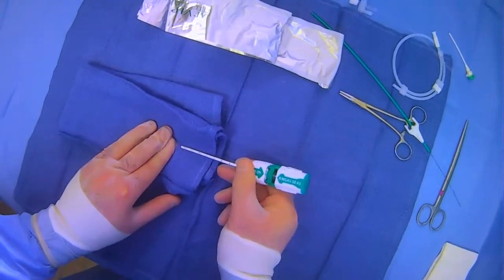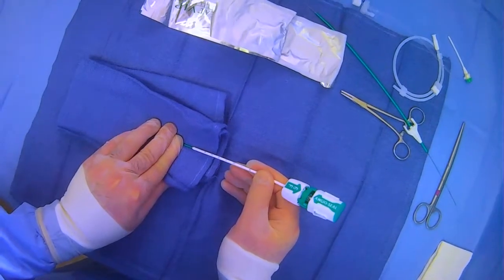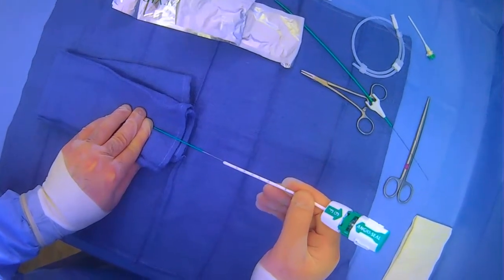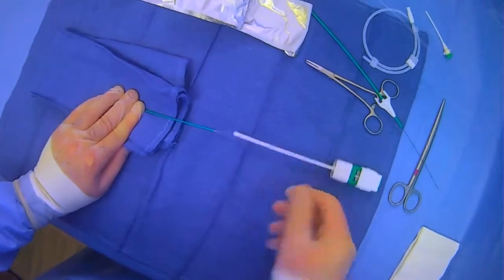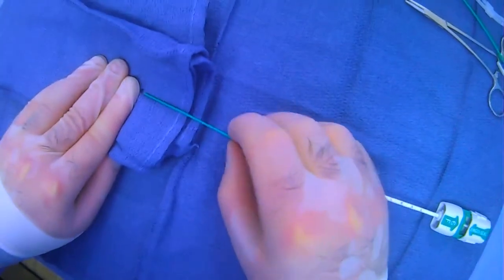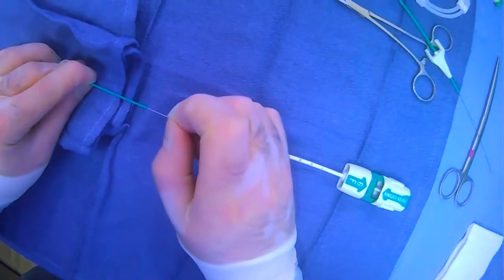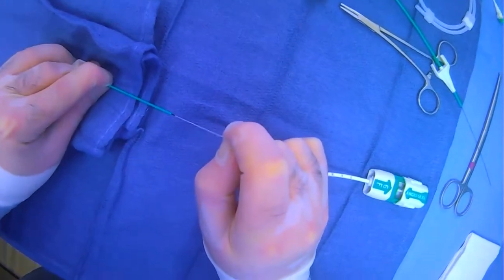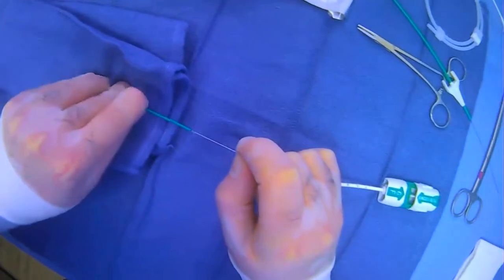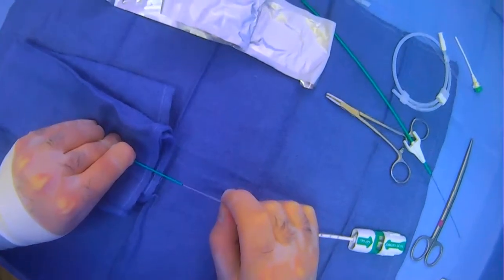At this point we're going to pull back the whole device and apply pressure as well. We'll pull this back as much as we can, continuing until we see the black indicator. In addition to pulling, we'll also push down with the tamping device to flatten the collagen plug. We push down until we reach that black indicator, which tells us we've tamped down appropriately.